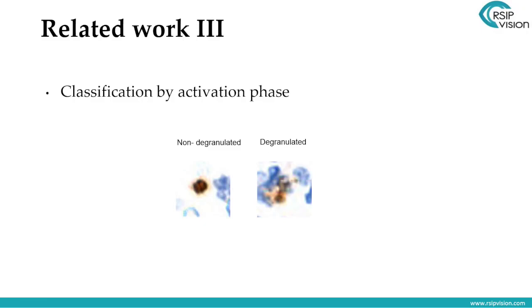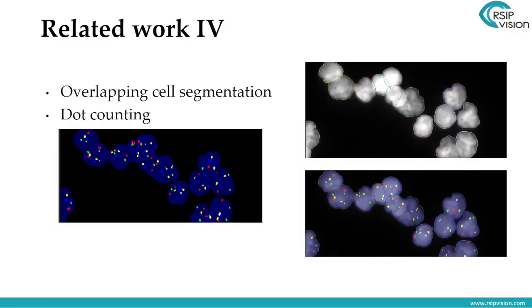In the past, one could have tried to define filters to pick this up by hand, or handcraft an algorithm, but it would be very difficult to get a robust result. The neural network is learning hundreds or thousands of filters from massive amounts of data, and this task has become tractable, which it really wasn't in the past.